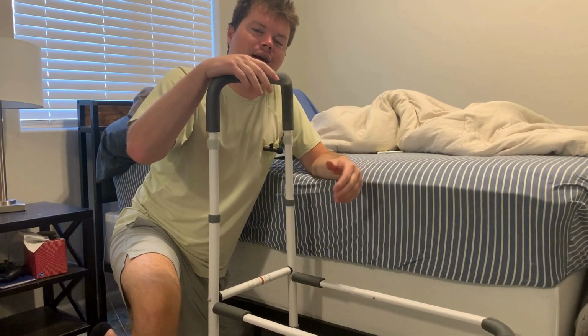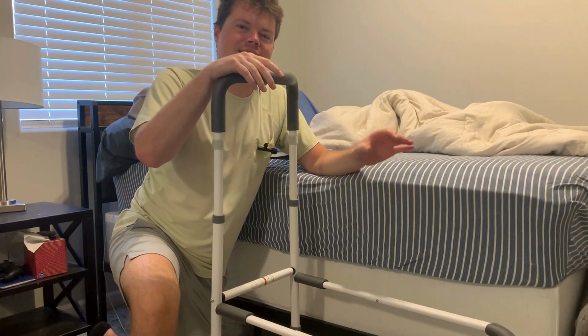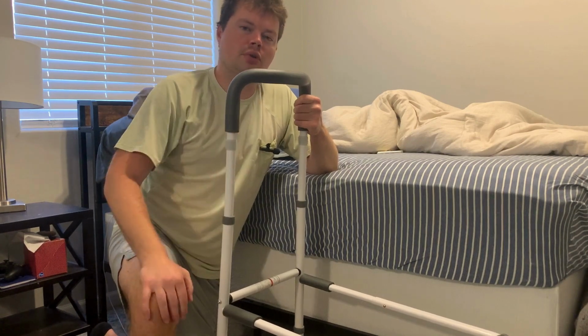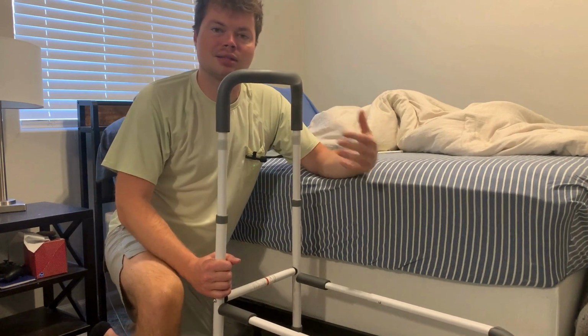All right, so let's get this installed now onto my bed. So it's very simple. All you need to do is lift up your mattress and slide it under there, and then you're gonna adjust the length of your legs to make it work with whatever height bed you have. I personally have a box spring. If you don't have a box spring, it'll still work out for you.